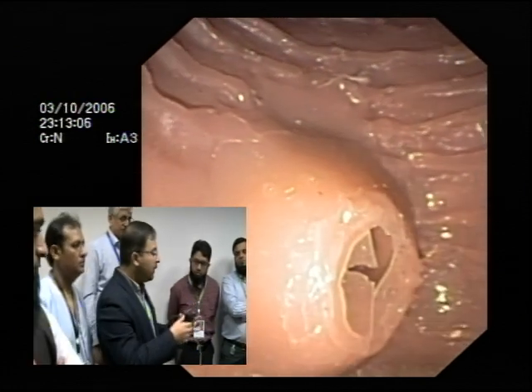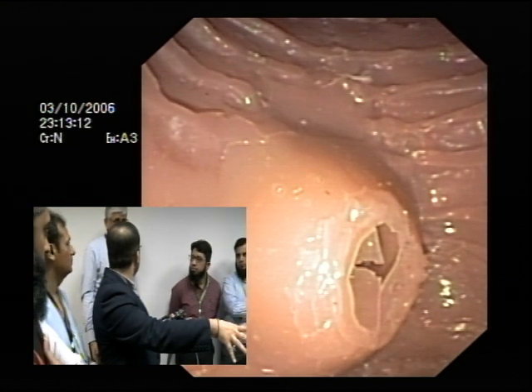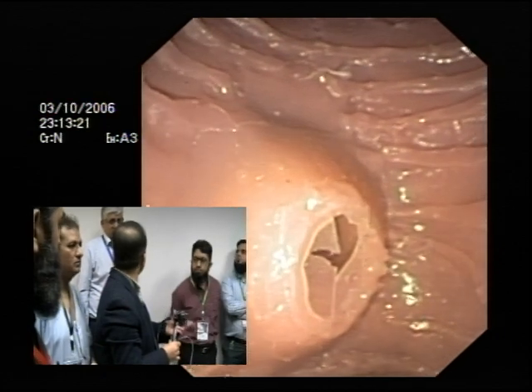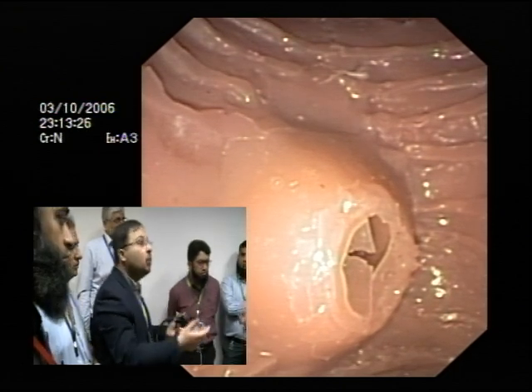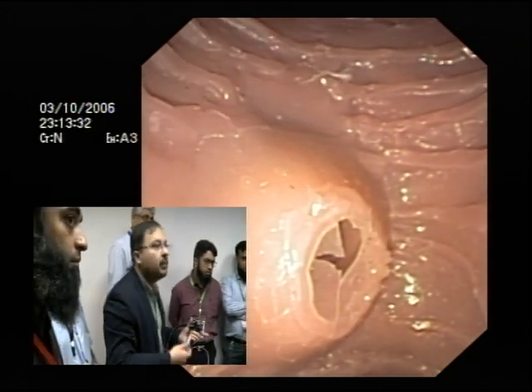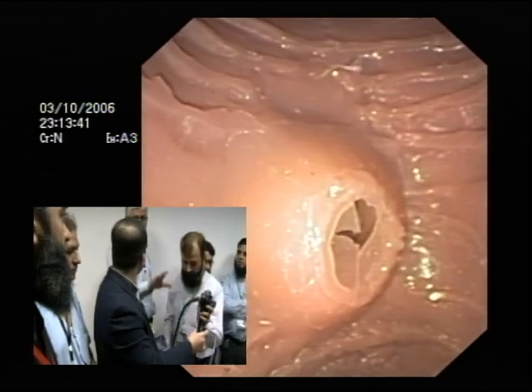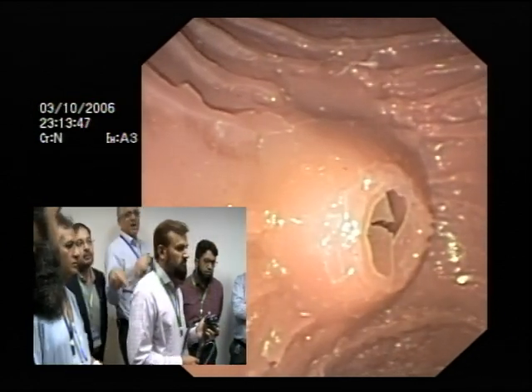One thing that we are ignoring over here is air. There is already air in the duodenum. You don't really need to put in a lot of air for most cases. Unless you're cannulating, once you've got everything in and I have the vision, I do not go for any more air. You don't need to. That's because most of the time you're doing gastroscopies, so in gastros your natural instinct is that you need air, and that instinct carries over here.